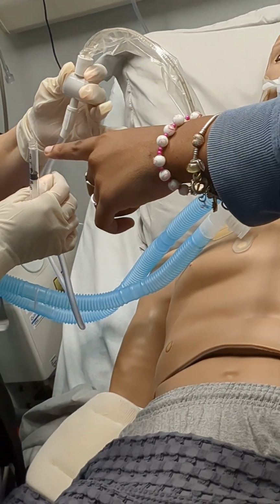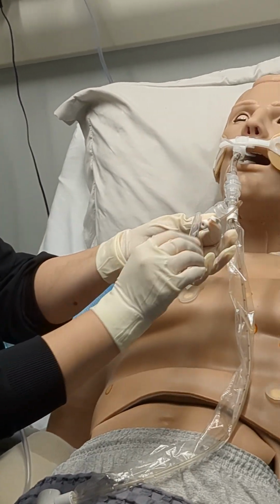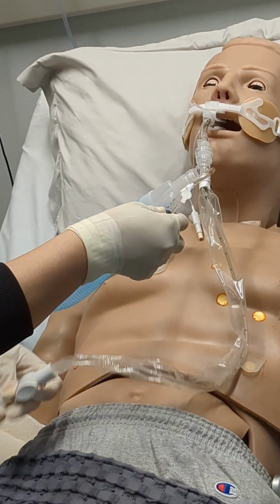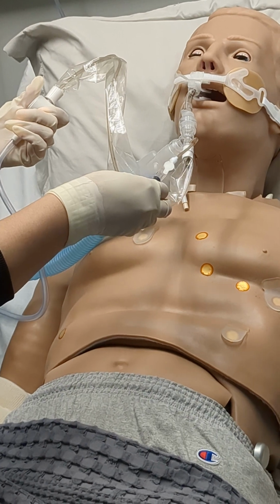Are you just filling that up to the top, like filling it all the way up? These already come pre-filled. Oh, okay. Yeah, so you would grab one, you would connect it, and then you would press advance and suction at the same time. When you press that button, it's sucking? Yeah, it's sucking.